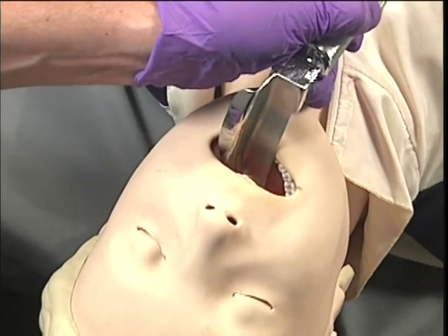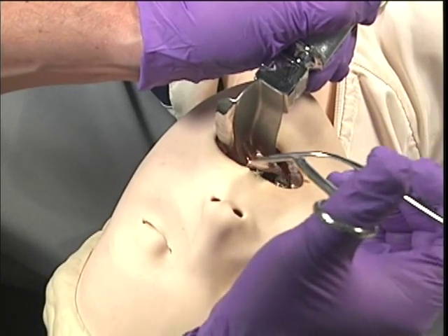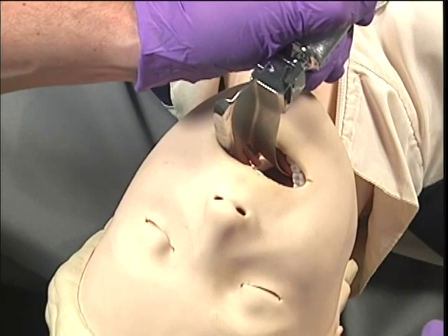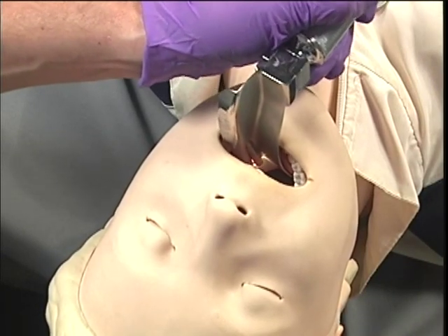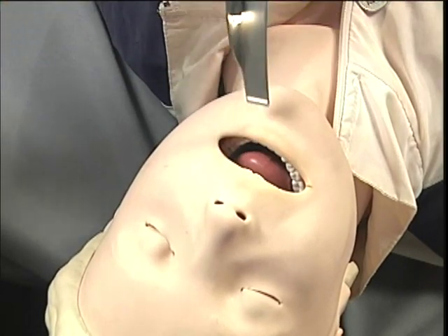Insert the blade into the right side of the mouth and displace the tongue to the left while visualizing the obstruction. Holding the McGill forceps in the right hand, remove the obstruction. Visualize the airway for any other obstructions before removing the laryngoscope blade.